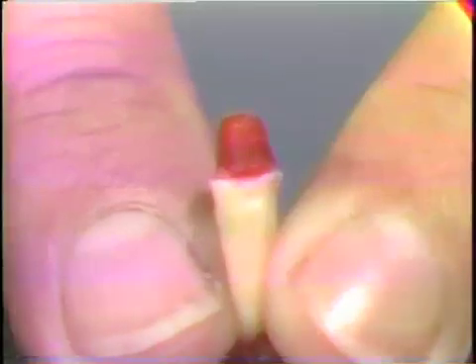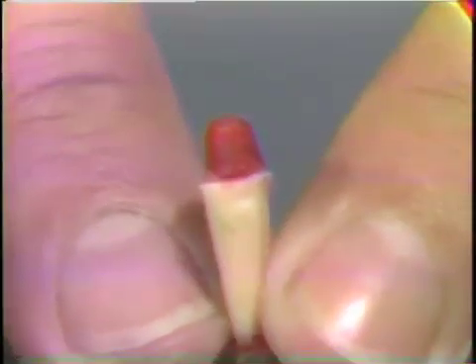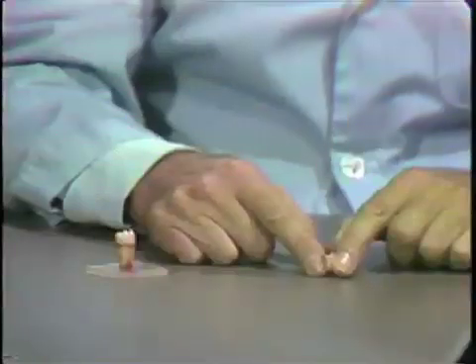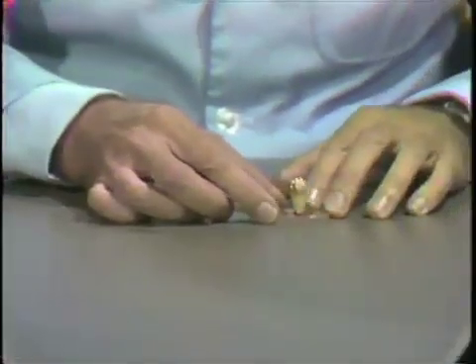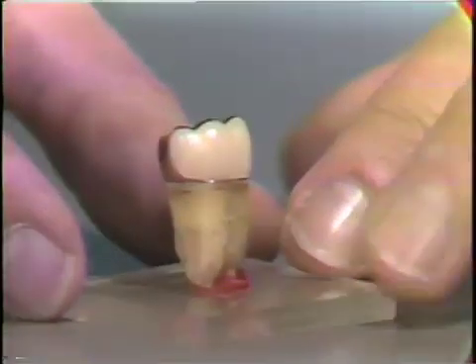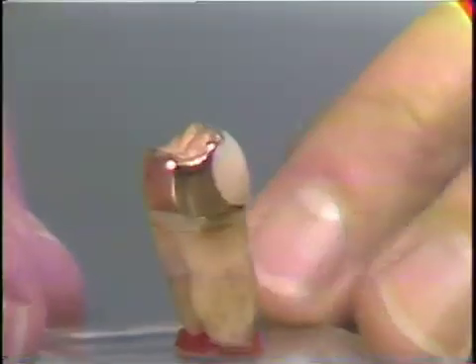So you see here the use of the composite resin as forming a core built on pins on a vital tooth. Let's return now to the first model just to summarize the amalgam core crown: a restoration which can be used as a bridge retainer on a vital tooth anywhere in the mouth in which most of the coronal tissue has been lost for some reason or another.